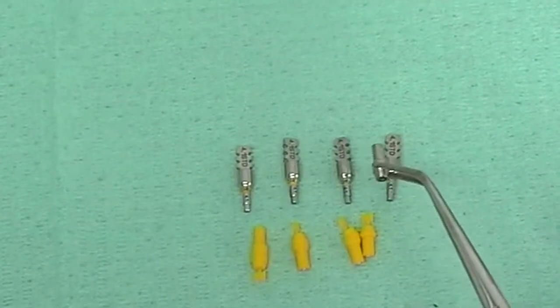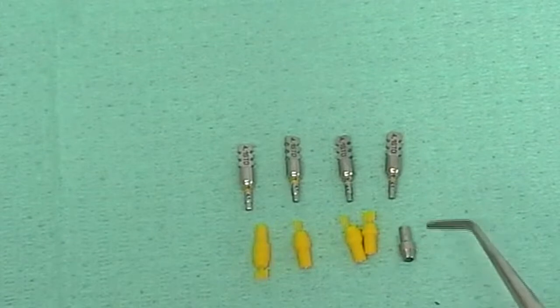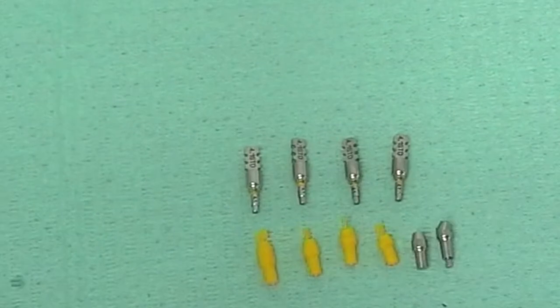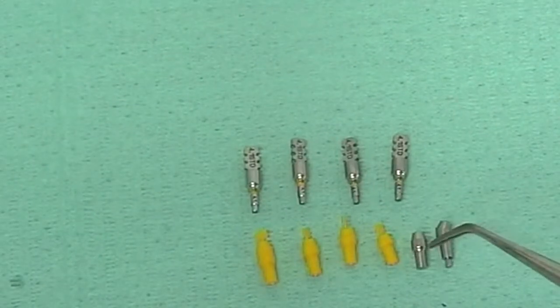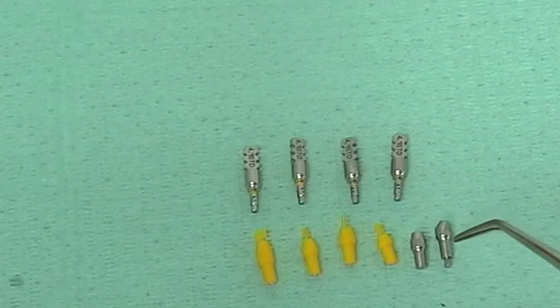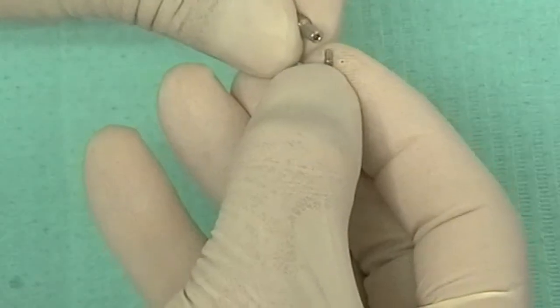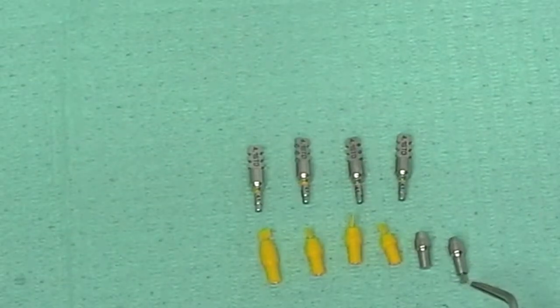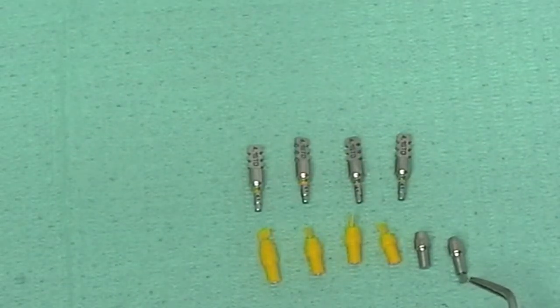As you can see, the straight abutments for screw-retained prosthesis do not have an apical hexagon, whereas the angled abutment has a hexagon separated from the rest of the abutment. The technician used the dental cast to determine the correct position for the hexagon and to fit it into the selected position.